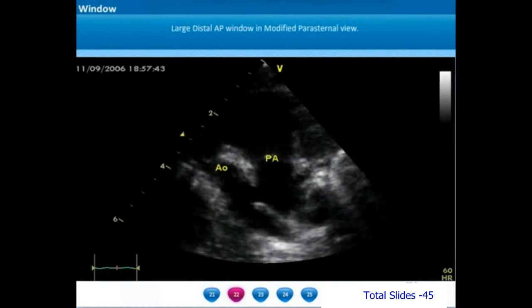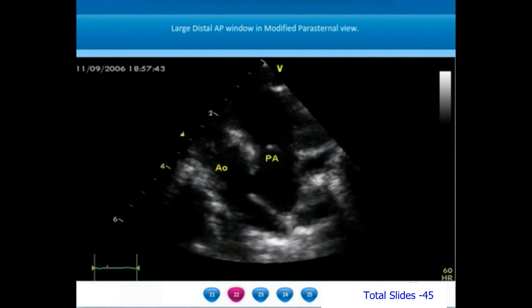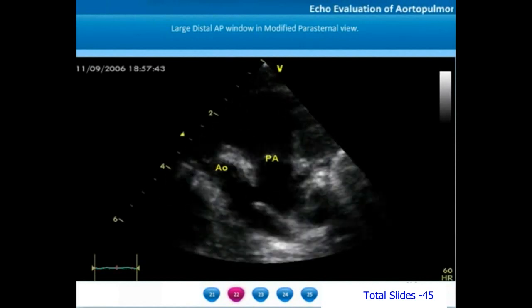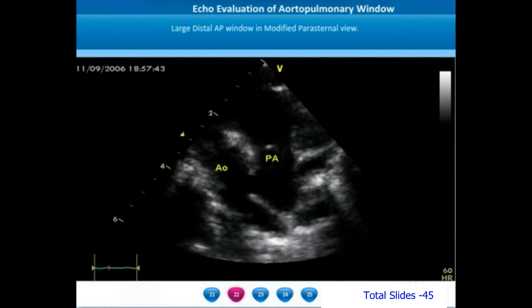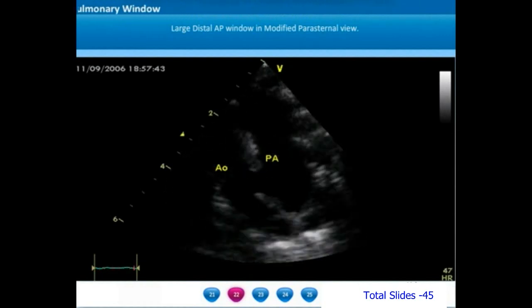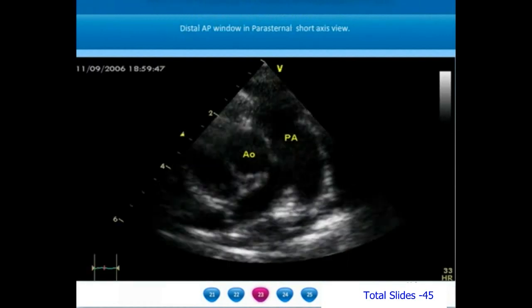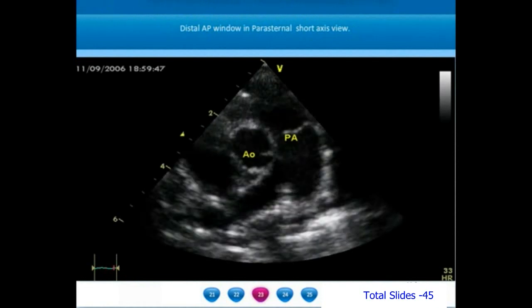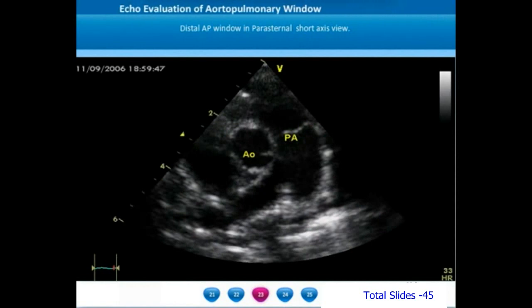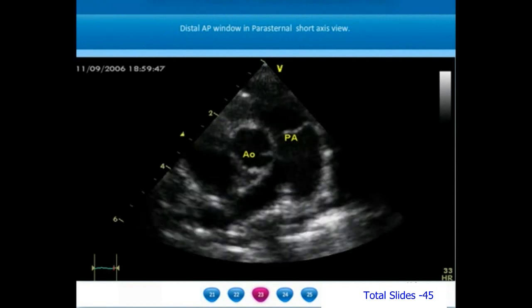We demonstrate another large distal AP window on a modified parasternal short axis view. We can notice the ascending aorta, the main pulmonary artery, and a large aortopulmonary window extending distally up to the pulmonary artery bifurcation. On parasternal short axis view, we appreciate the pulmonary artery bifurcating into the right and left pulmonary artery, and immediately adjacent to the right pulmonary artery origin, we can notice a defect in the aortopulmonary septum — this is a large distal AP window.